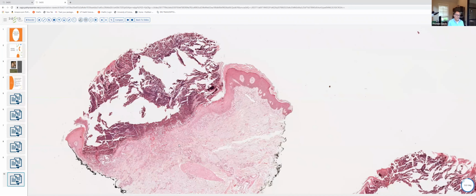And of course, clinically, the patients present with papules or nodules with a central umbilication. RPC, of course, can be inherited in an autosomal dominant fashion. In that instance, usually it occurs in younger individuals, earlier onset, at sites of trauma. In the acquired form, which is more common, we tend to see it in the setting of chronic renal failure and/or diabetes. So that's about all I have, kind of a whirlwind tour of histological lookalikes.